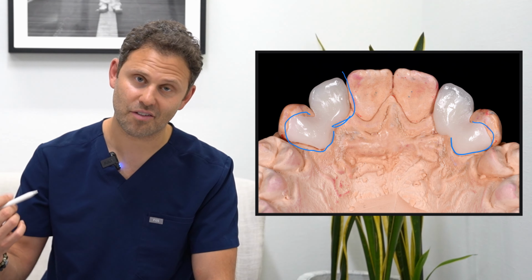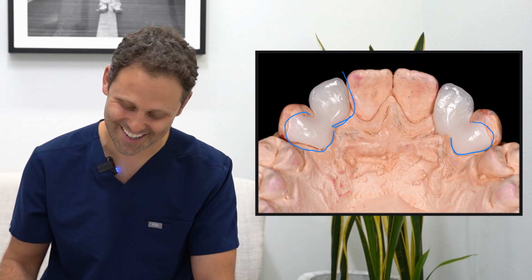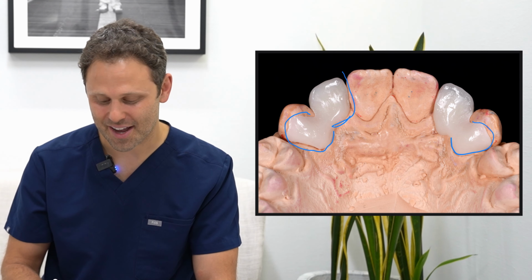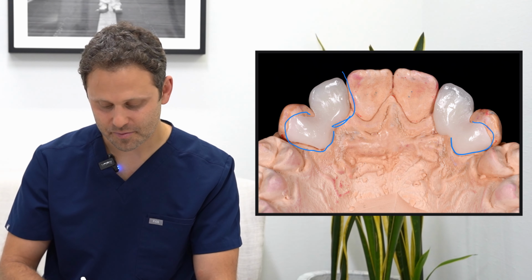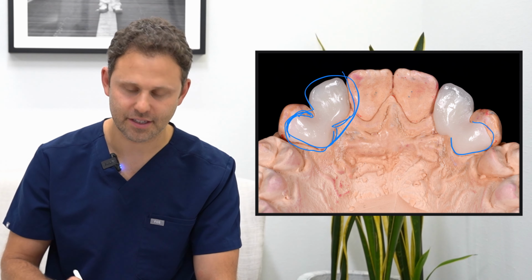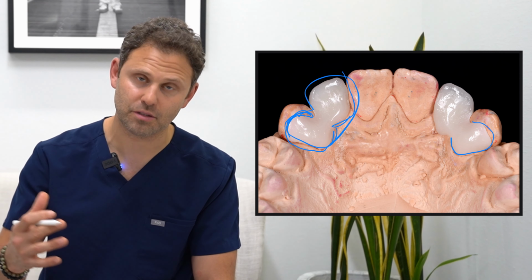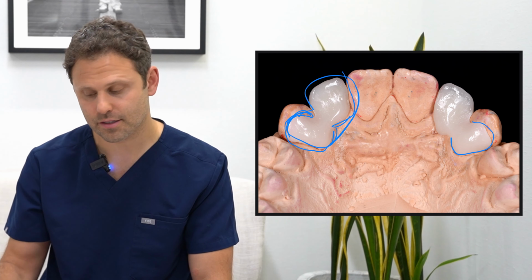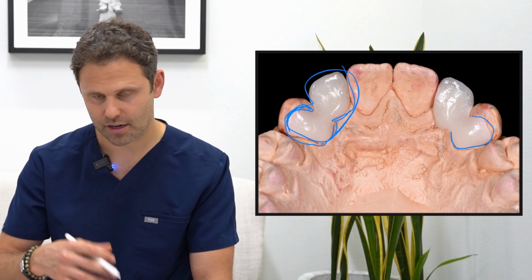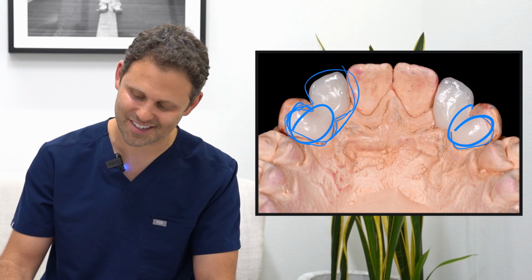And when he comes to the office to see our hygienist, he has no excuse as to why he's not flossing in that area. And also, as you are able to bond to this one tooth, I believe that those single-sided Maryland bridges are just as strong as double-sided wings. So we call them wings in dentistry, and I think that 2 wings in his mouth is good enough, 1 on the left and 1 on the right.